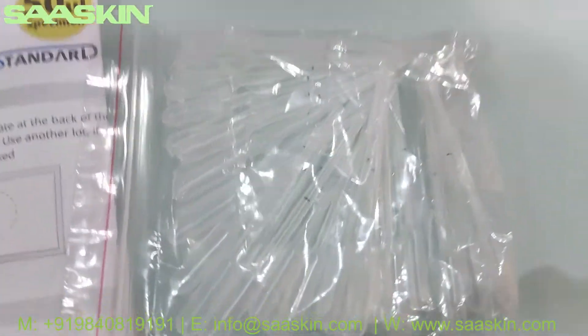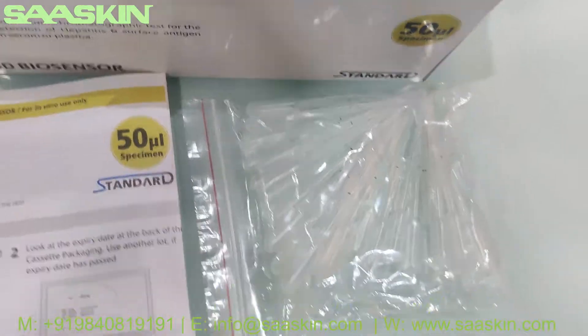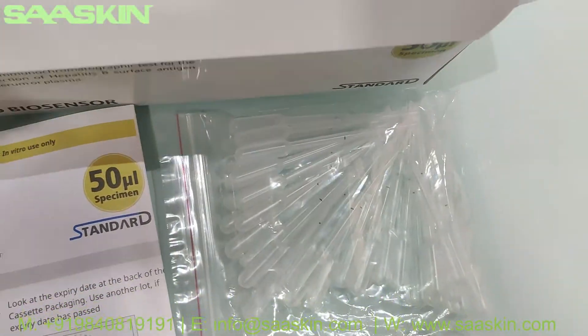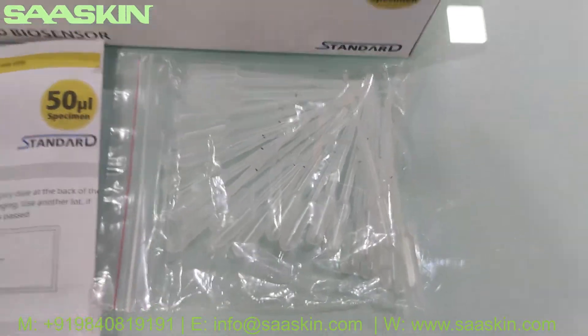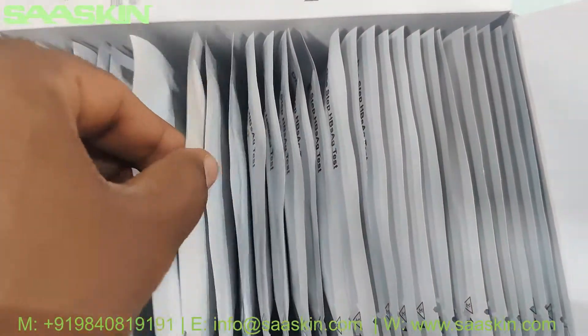Here are the droppers — the specimen transfer devices. There are 30 pieces inside. And there are 30 test cassettes inside the box. Let me take out two test cassettes.